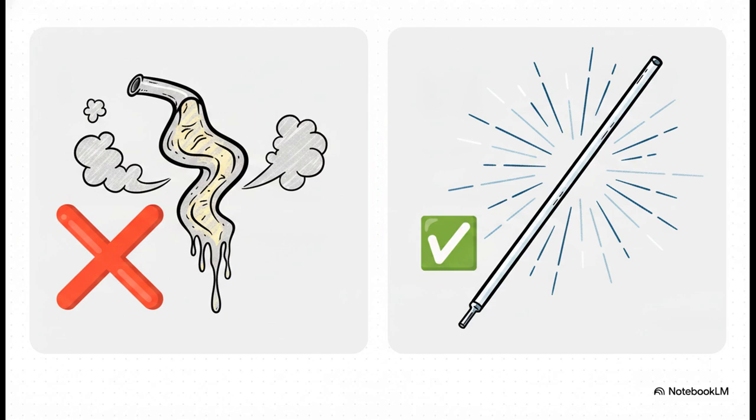The device immediately fails the moist heat pathway. Saturated steam at 121 degrees would simply melt and distort the heat-sensitive polymer catheter. It's a non-starter. However, material screening confirms that the NeoCath's polymers and adhesives remain completely stable even when tested at the maximum radiation dose. Therefore, radiation is accepted as the clear, validated pathway for this product.